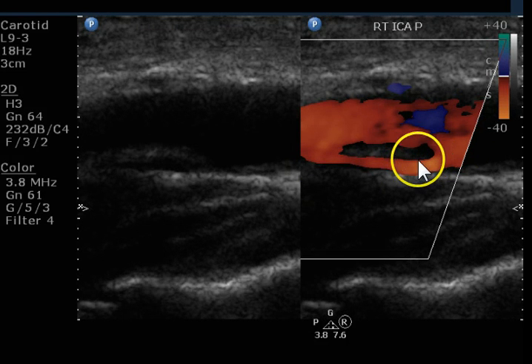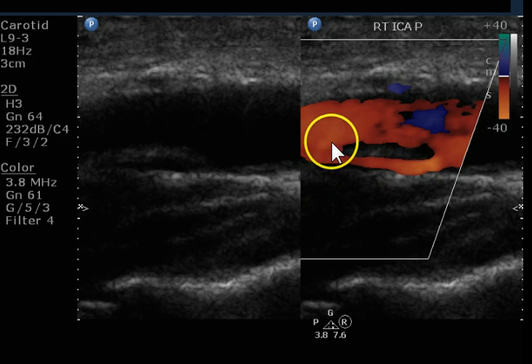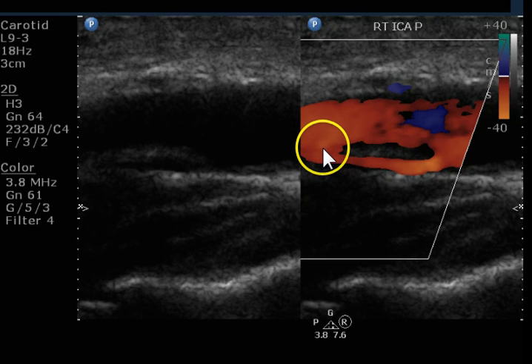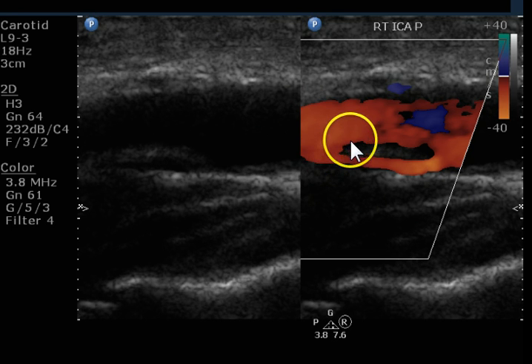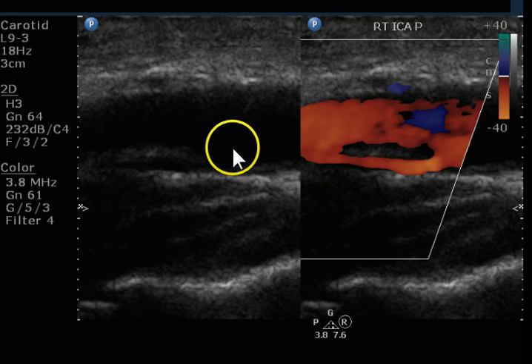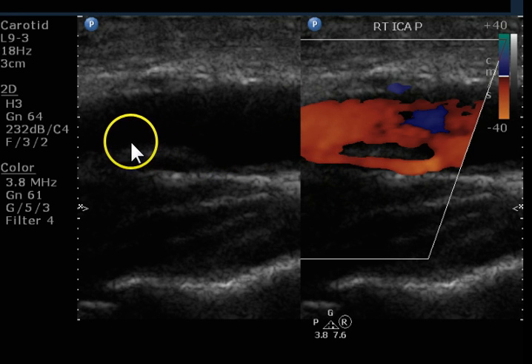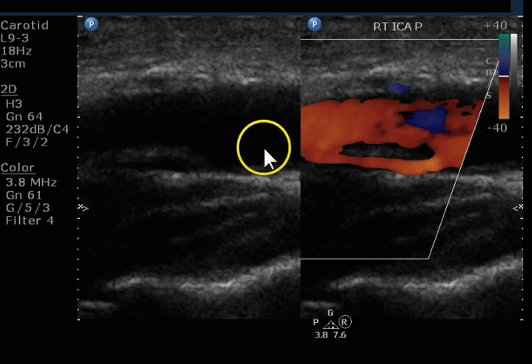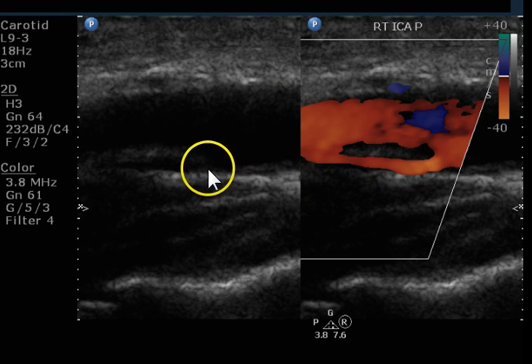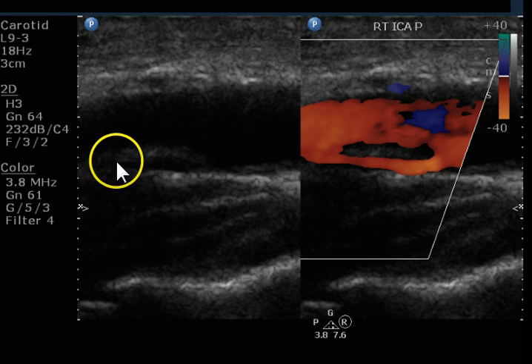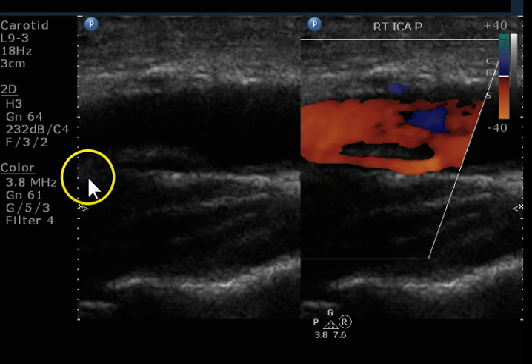Here's some more of the false flow lumen and part of the intimal flap. This may be where it re-enters, but this could just be motion of the flap. It looks like it continues onward here. So here's the intima, here's the flap, and flow goes underneath the flap and continues in this direction.